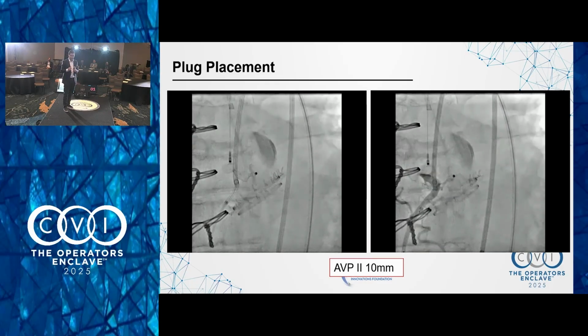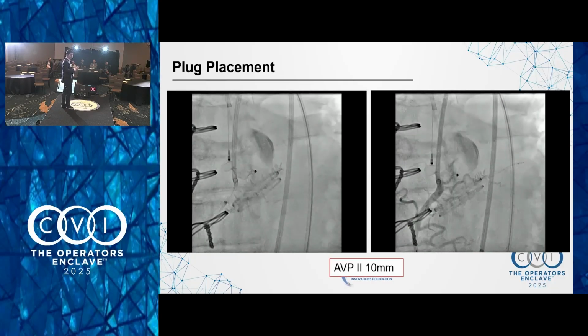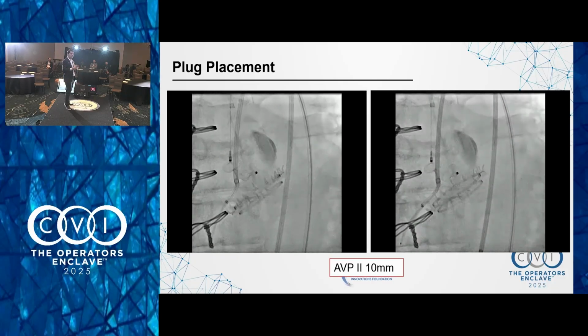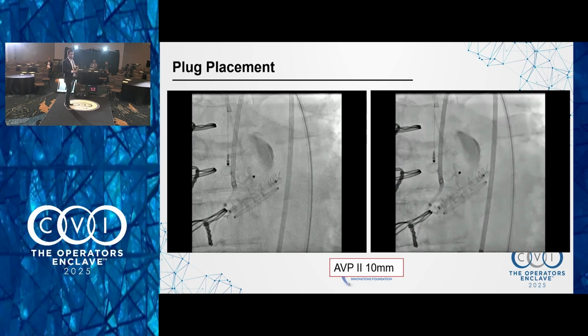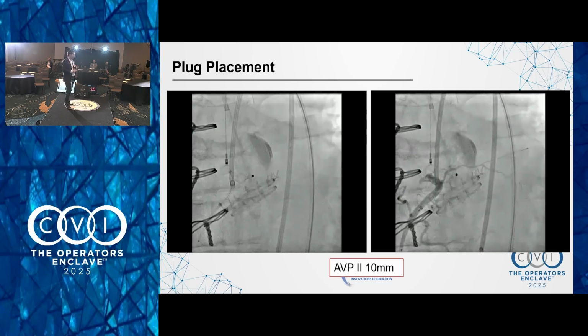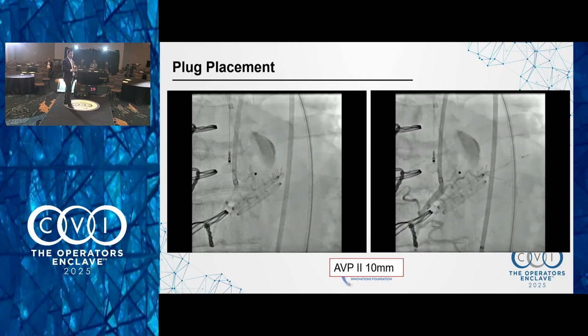If you look at the paper, or actually in the box, the Cordis theoretically doesn't have the biggest lumen, but I learned it the hard way that day. I spent literally 30 minutes trying to push my device and it would just not come through. It got to a point where I said, just find me a Cordis, and it literally pushed the device through very easily.